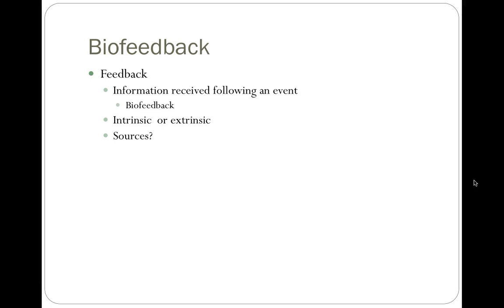Sources of biofeedback are really broad. We have the biofeedback machines, which is what you're going to learn how to use, which give visual and auditory feedback. There's more advanced, what we call EMG biofeedback, which is usually what's done in research, where individuals can see more of a graph of their muscle electrical activity. Pain is a source of feedback, right? Pain within the body tells you, hey, I'm doing something right or I'm doing something wrong. That would be an intrinsic form of biofeedback.